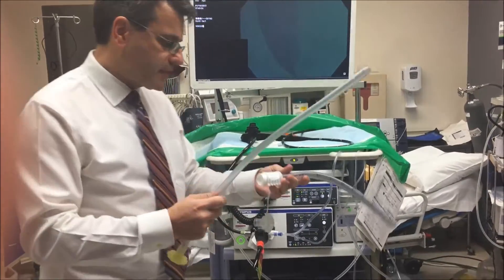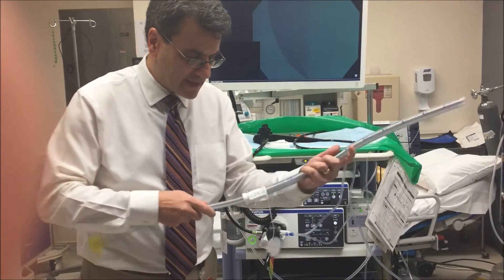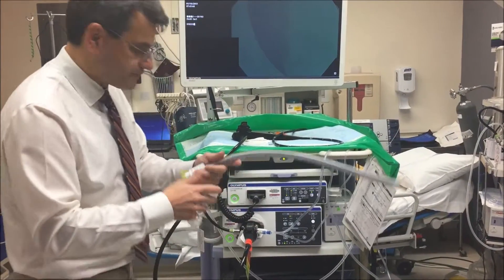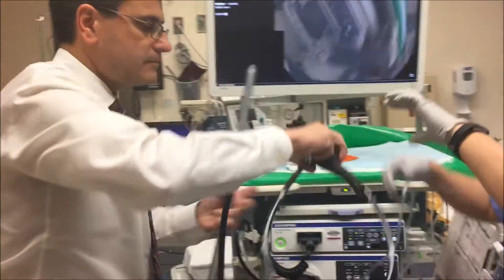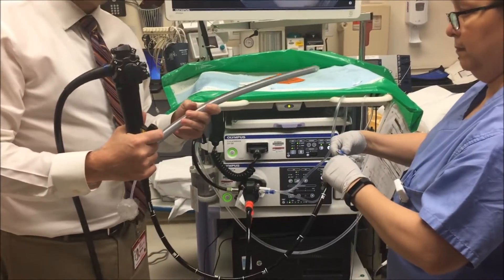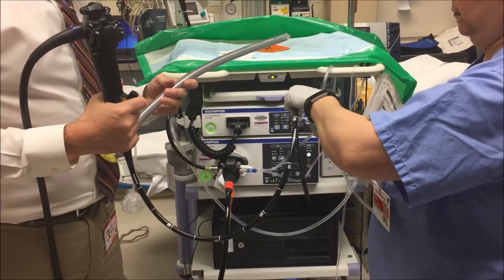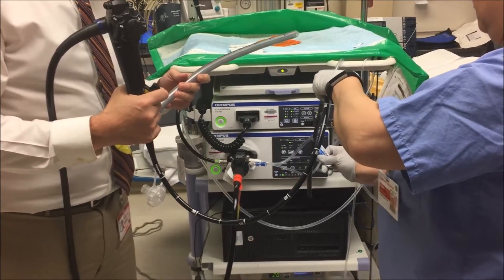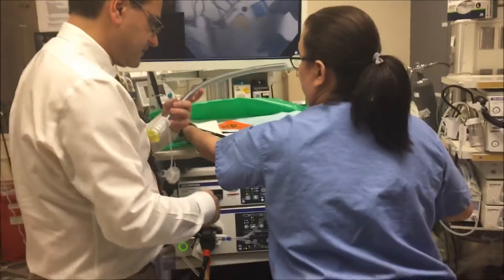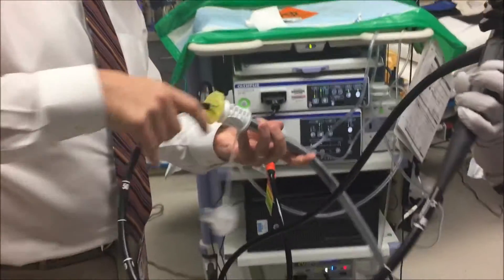So first we prepare the overtube. We take the tube and put the inner tube in — this is the inner tube — and we tighten it up like that. Then we have to take some gel. Here's the scope — we'll put a little gel on there so we can pass it through, because if you don't put the gel on it's very difficult to pass it. Put a whole bunch on. Now we take the tip of the scope and basically this goes through the little opening here, and it should pass through pretty easily with the gel.